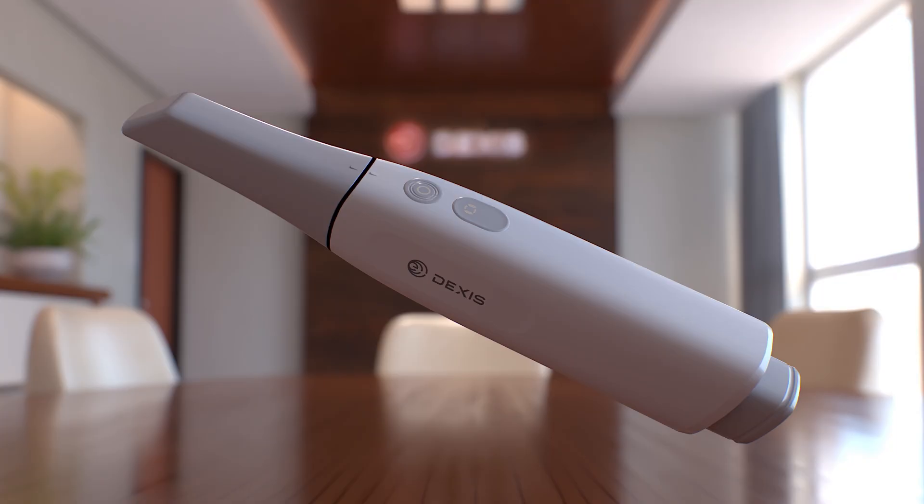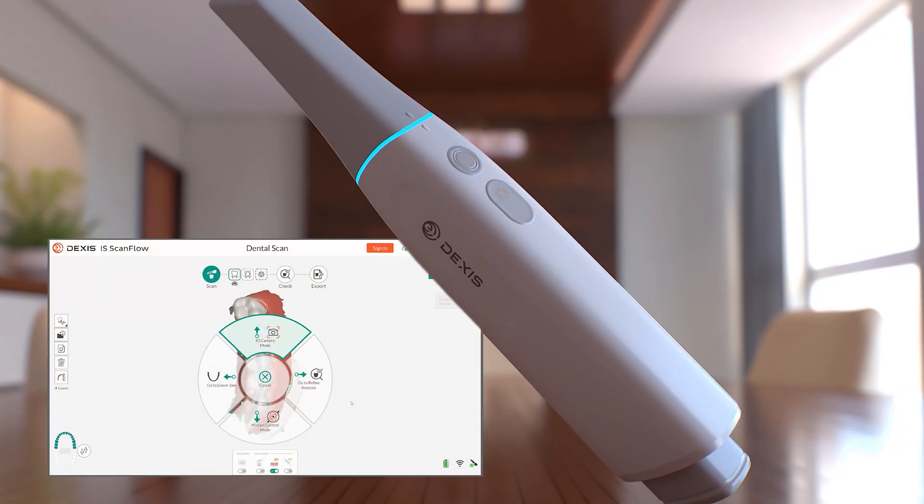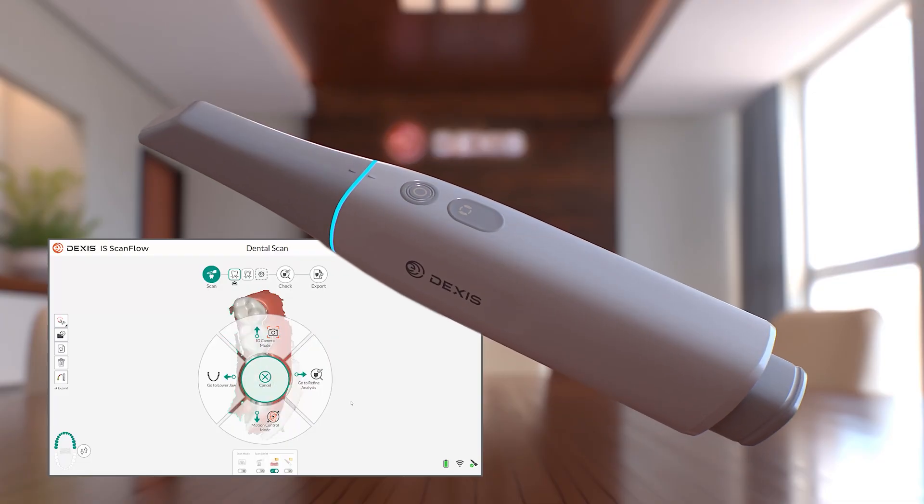Operating the scanner is simple and intuitive. Press and hold the power button for three seconds to turn the unit on or off. Press the power button for one second to start and stop scanning. Press and hold the mode button to enter genius control mode, where you can navigate menus by moving the scanner itself — no extra clicks, taps, or distractions.